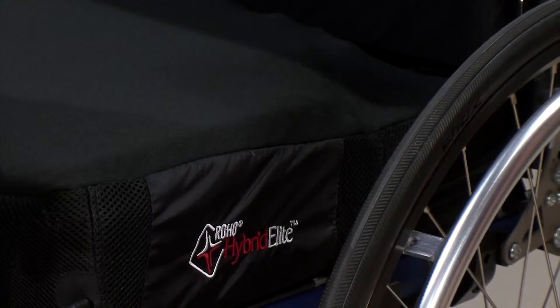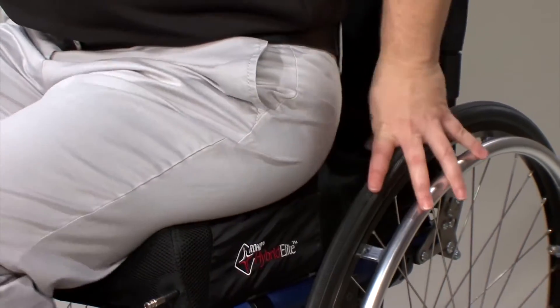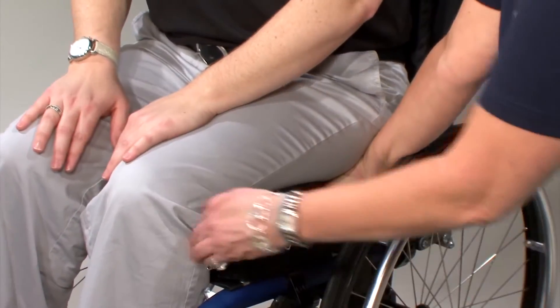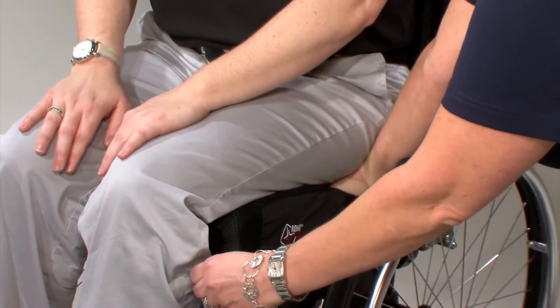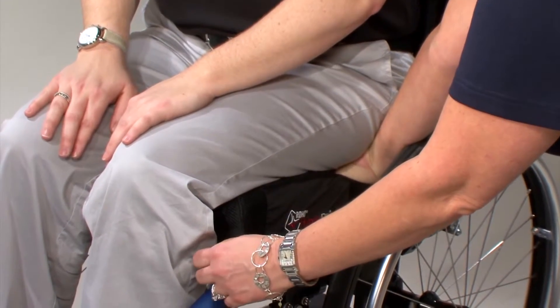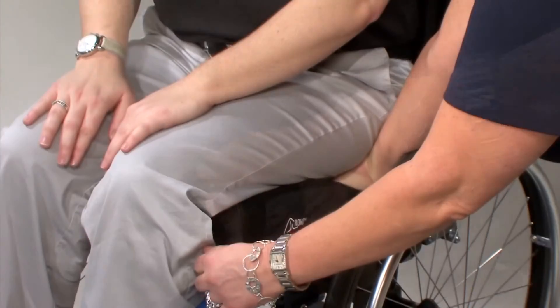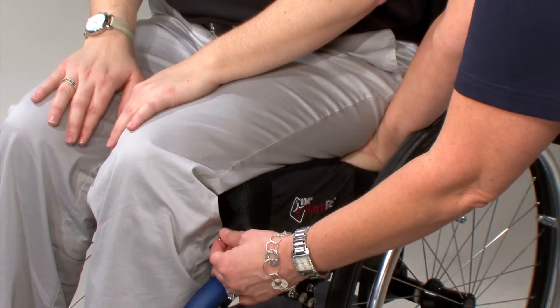After over-inflating the cushion, have the individual sit on the cushion, making sure the bony prominences are supported by the air cells. Check to make sure the cushion is properly sized to the individual and the wheelchair. Consult a clinician as needed. Next, slide your hand between the cushion and the individual's bottom. Lift the individual's leg slightly and feel for the lowest bony prominence. Then lower the individual's leg to a sitting position. Once this has been achieved, turn the valve counterclockwise to let out air, while keeping your hand under the user's lowest bony prominence.